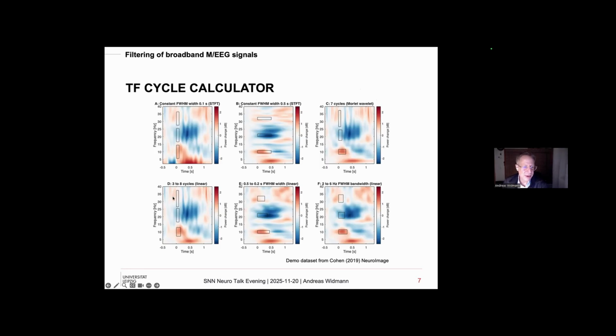In some traditions, in particular the EEGLAB community now, so SCCN and others, they use a linear increase of cycles from low to high frequencies. Also there's an Eric Rawls preprint that suggests or uses that. So it's basically a softer version of the constant cycles approach. Again, they try to balance resolution at high and low frequencies, less extremely than with constant cycles.